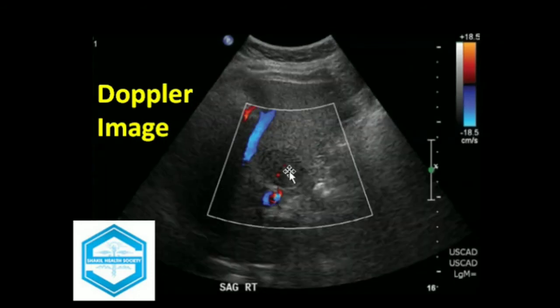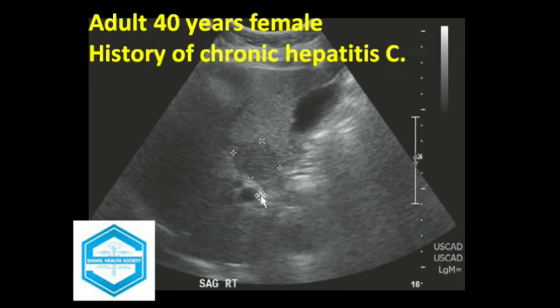This image also shows some peripheral or feeding vessels. To review, this is the solid mass. The liver parenchyma and echotexture is within normal limits.